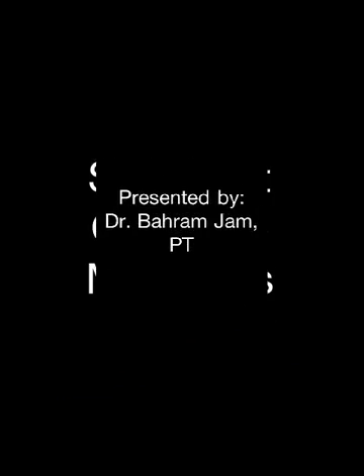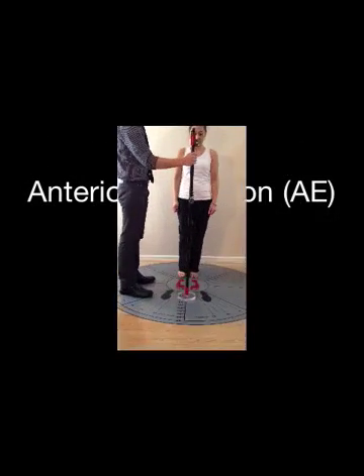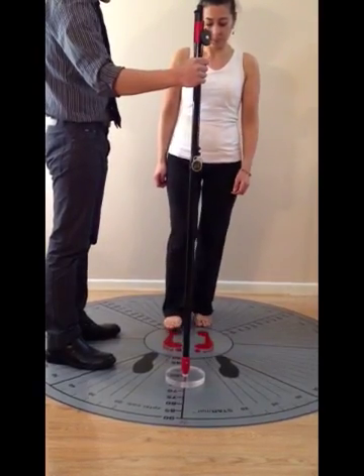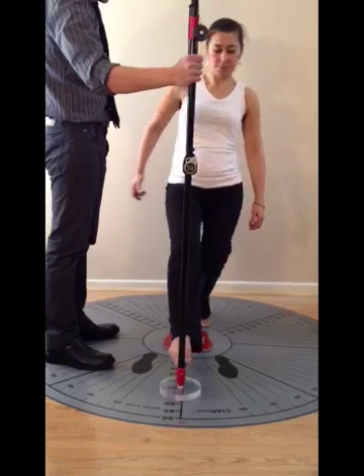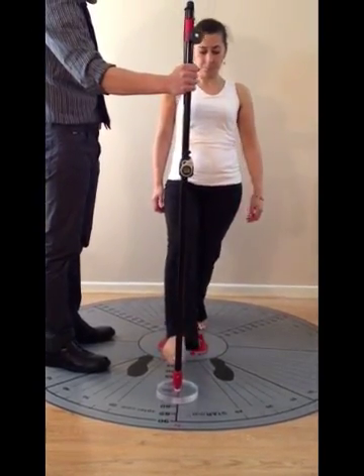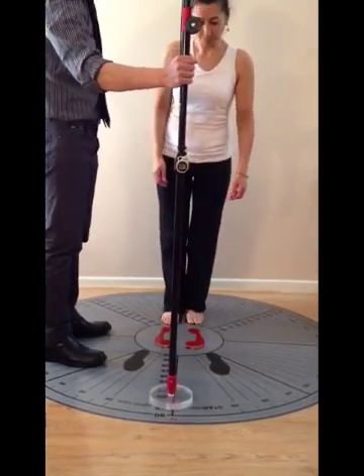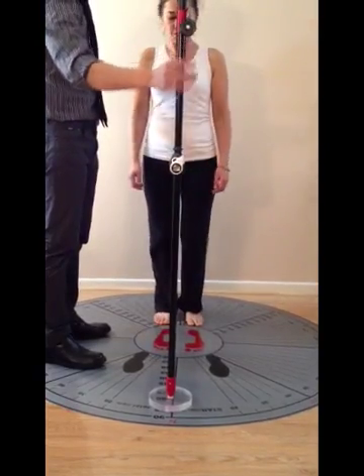Star Mat outcome measures: the anterior excursion test. The patient stands on the back black footprints with the toes just outside the center circle. The star pole is placed on the 50-centimeter mark. The patient is instructed to reach forward with the big toe and lightly touch the red base and return. After each successful attempt, the pole is taken back by 10 centimeters. The maximum distance reached with control and without falling is considered the outcome.